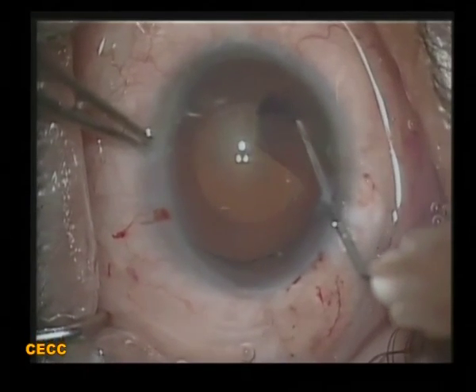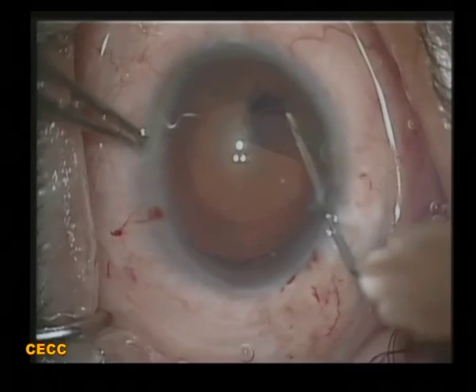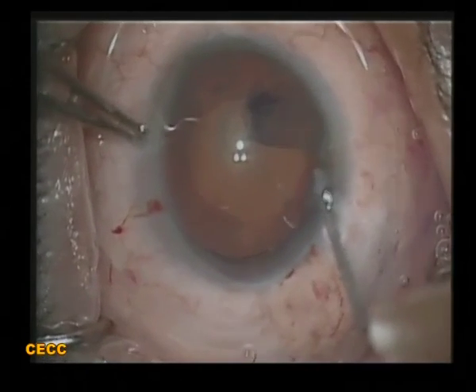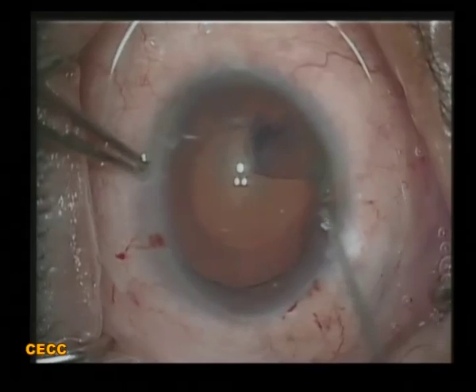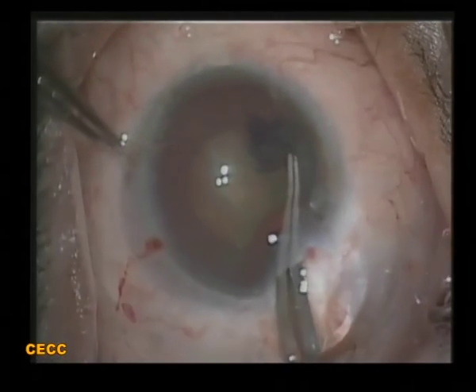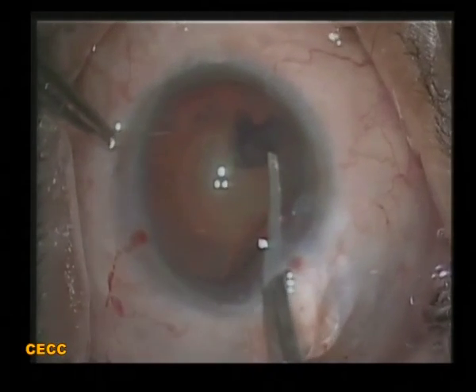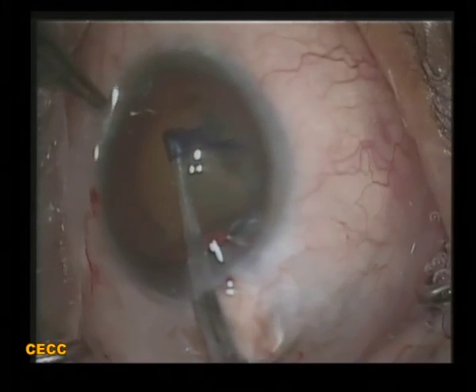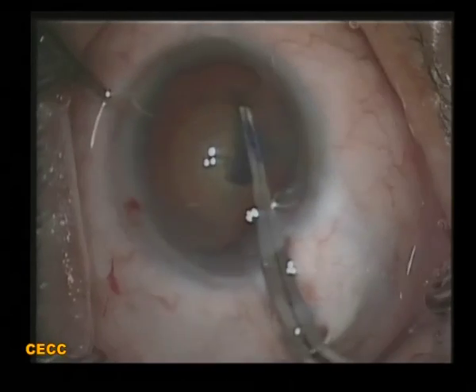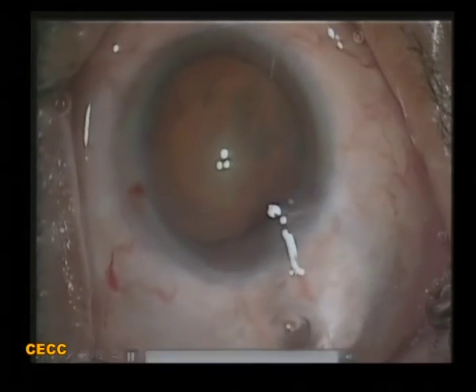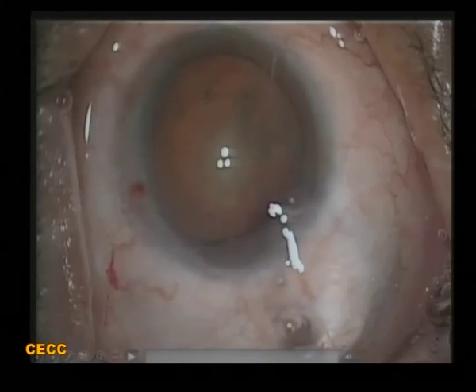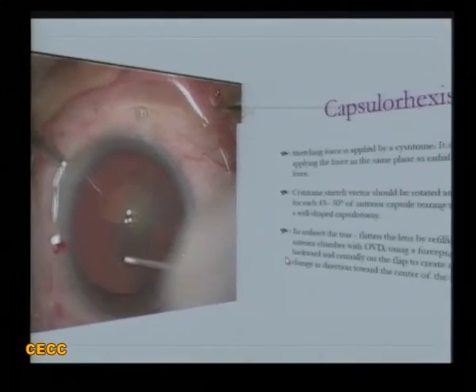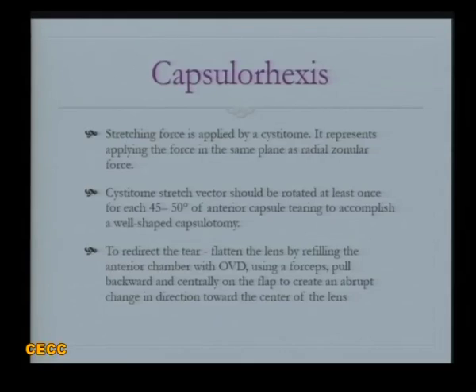I am trying to bring it back but realize it has already gone outside. I can't bring it back with a cystotome, so I take a capsulorrhexis forceps and pull it inwards and backwards. We now have a very large and eccentric rhexis, which is not desired, with a peripheral extension in the shape of the rhexis.